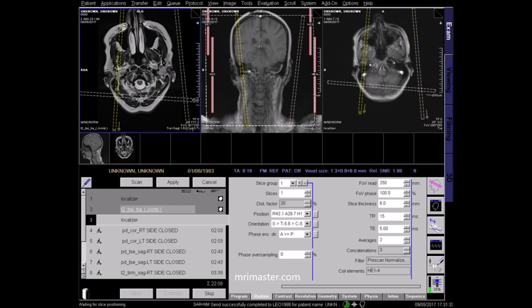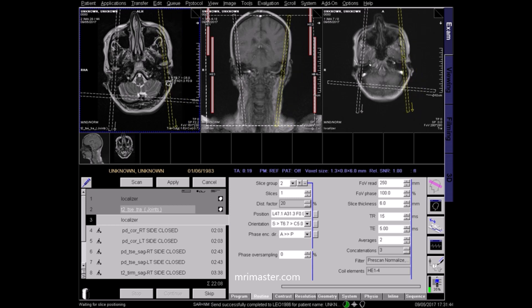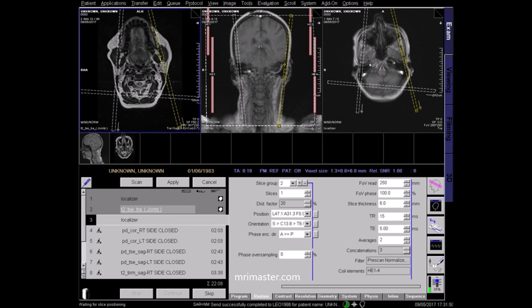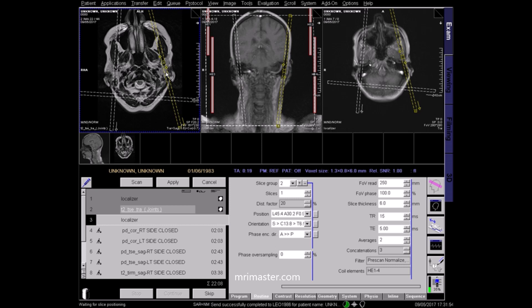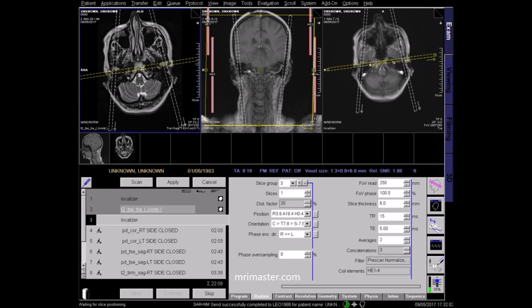Angle the right sagittal localiser perpendicular to the length of the right mandibular condyle, and the same on the left side. For the coronal localiser, position the block through the length of the condyles. On the coronal plane, tilt the blocks angling along the right and left rami of the mandible, and apply.